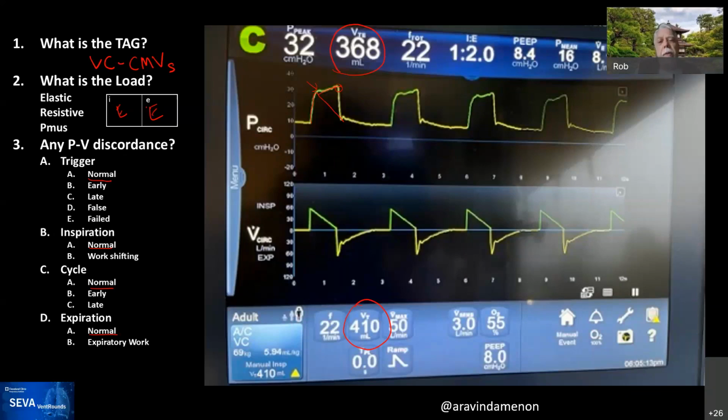And it's interesting that this comes up, because I've just now reviewed a paper where people were trying to compare the accuracy of the ventilator's flow delivery with, let's say, what the ASL says or an external monitor. And if you don't have both sources corrected to the same conditions, body temperature and pressure saturated, or atmospheric temperature and pressure dry, there are four different ways to do this, then the differences you see in the measured volumes are only due to calculation errors and not due to actual delivery control errors.